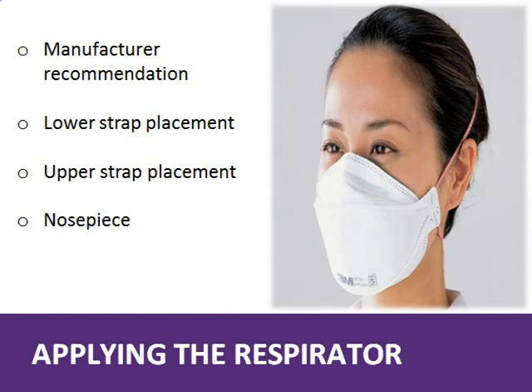On most N95 models, the nose piece is meant to be molded to the user's facial structure, using his or her index fingers of both hands to press gently against the metal strip until it molds to a snug fit. See the next slide for a video demonstration on applying one type of N95 respirator.